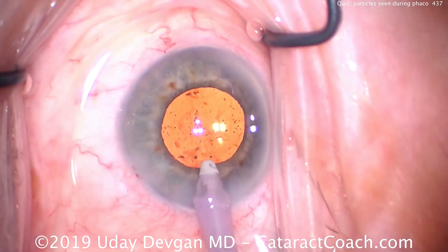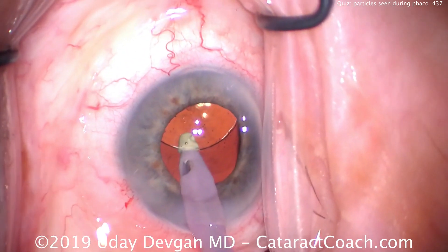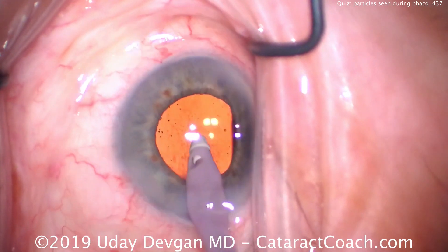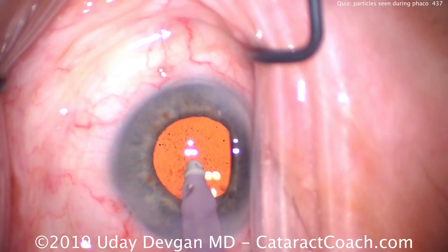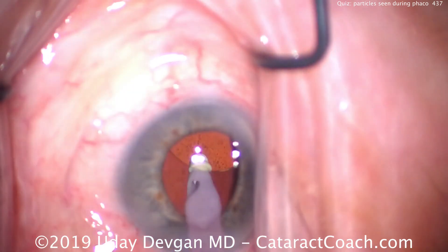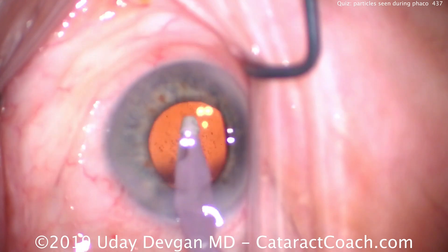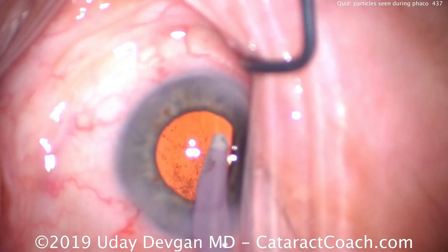What's happened is tiny, tiny fragments of lens material have gone into the anterior vitreous. The reason is they go through the defect in the zonular support. These tiny little fragments, due to the fluidics that we use to wash the cataract out of the anterior segment, some of the small pieces fall back into the anterior hyaloid face. The anterior hyaloid face is intact and the posterior capsule is intact. We wash out the viscoelastic from behind the lens, and still those particulate pieces — the little peppering of pieces — those are tiny cataract fragments in the anterior hyaloid face.